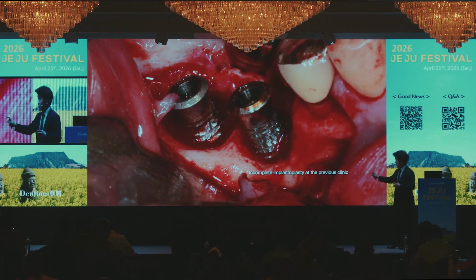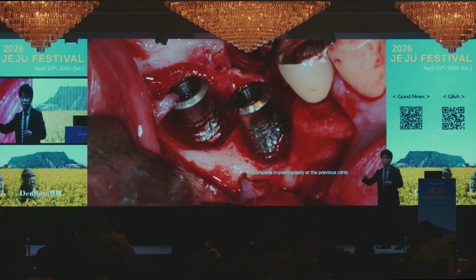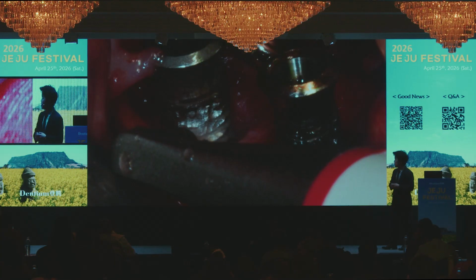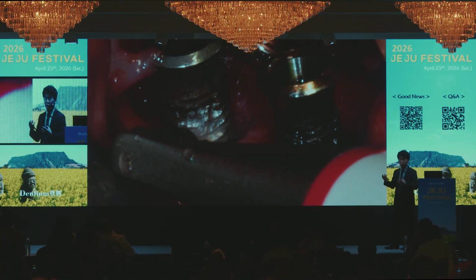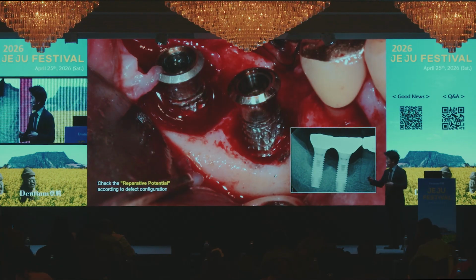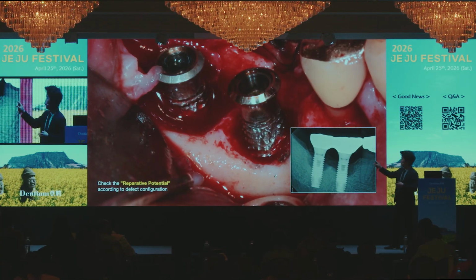Previously in the clinic, implantoplasty was incomplete. Dr. Bonje takes 10 minutes for polishing, for refining one implant, so it is incomplete. Anyway, he wants to maintain the implant. So I do the decontamination and check the reparative potential.